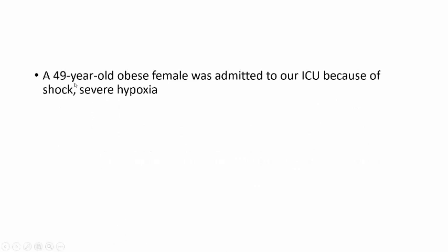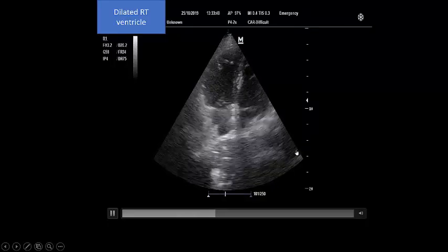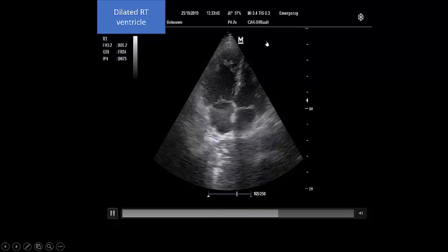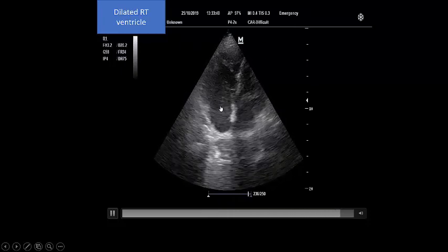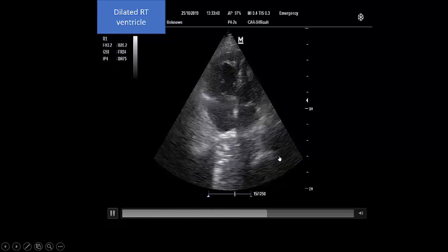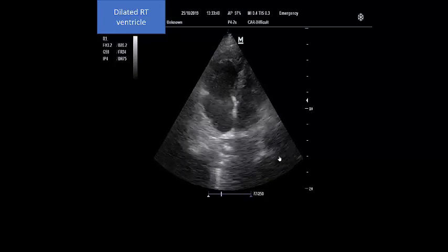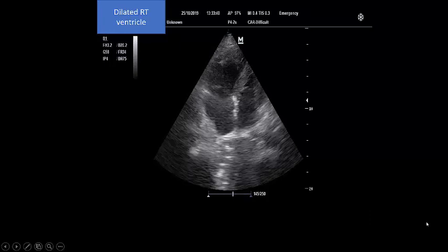We faced a 49-year-old obese patient admitted to our ICU because of shock and severe hypoxia. Obese, shock, severe hypoxia — you will think of pulmonary embolism. When we saw the four-chamber view of our patient, we found a dilated, ballooning right side which is greater in volume than the left side. That means with an obese patient presenting with hypoxia and shock, we should think about pulmonary embolism.